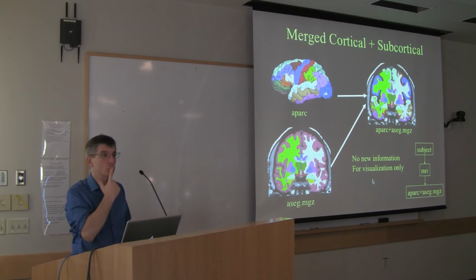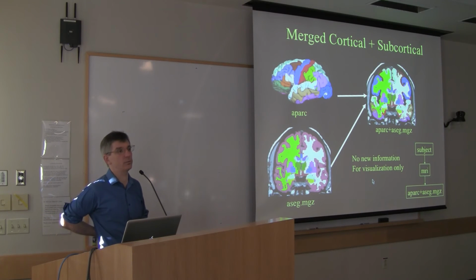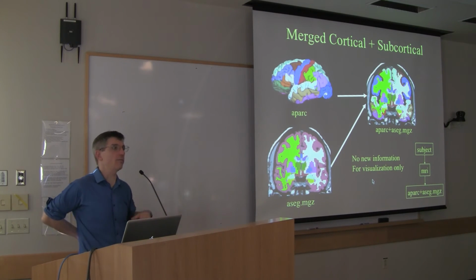Is it correct that the aparc does not have to fill in every voxel? Meaning that aseg has to label every voxel, but the aparc will... The aparc has to label every single vertex in cortex. So it's only working on cortical structures. But it maps back into the voxel space, right.